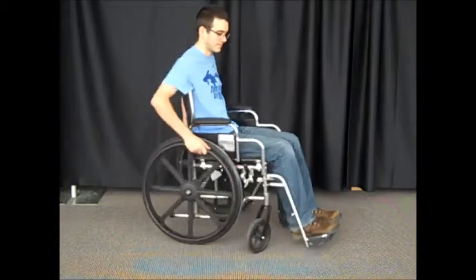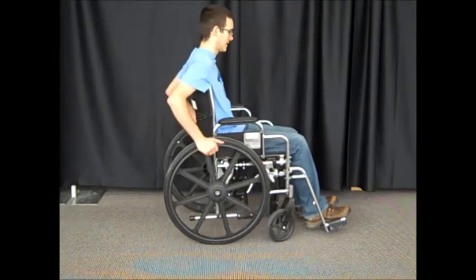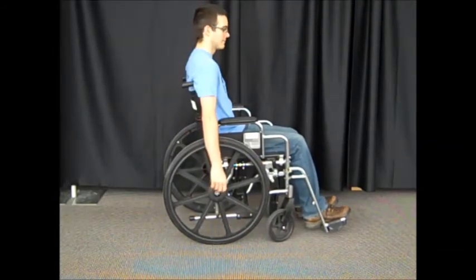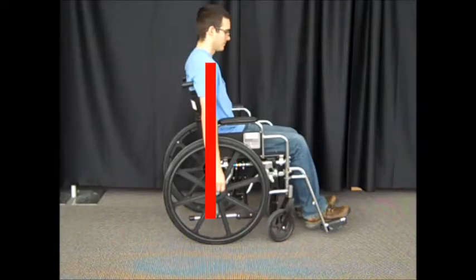Ideal positioning for the body in a wheelchair has the center of mass as close to the main axle as possible. This decreases rolling resistance, decreases downhill turning tendency, and increases propulsion efficiency. A way to check the center of mass location is to see if relaxed arms align closely with the main axle. This places the shoulders over the axle, allowing the greatest range of motion during the stroke. You can see the horizontal shoulder positioning is proper in this situation.